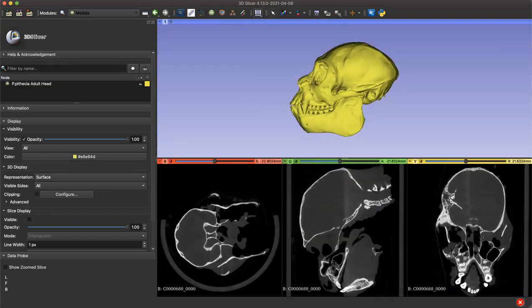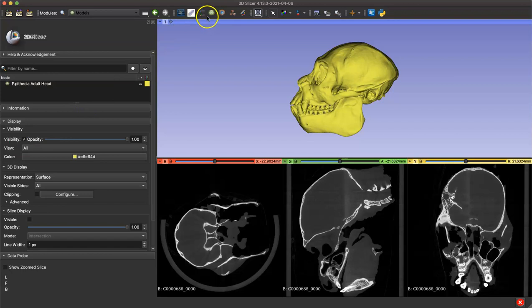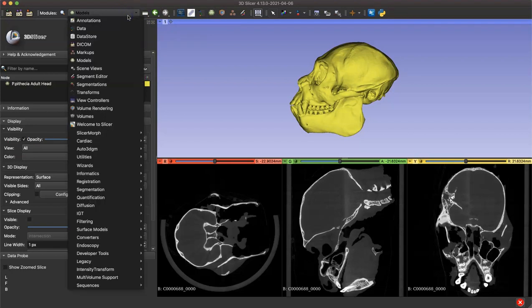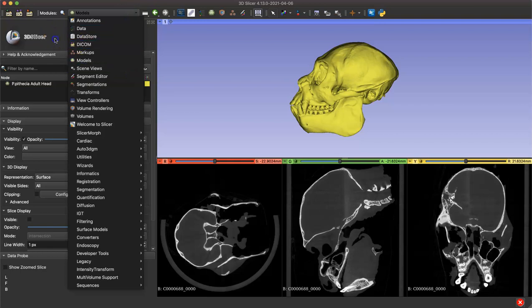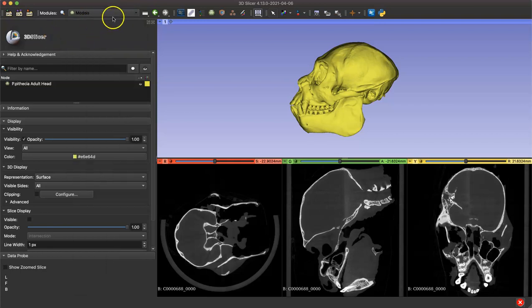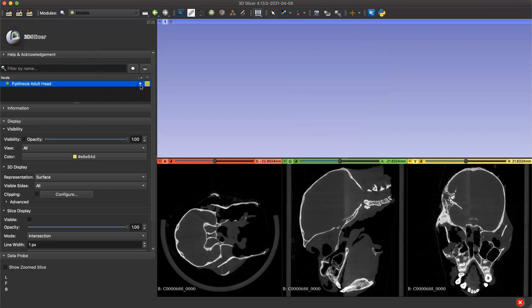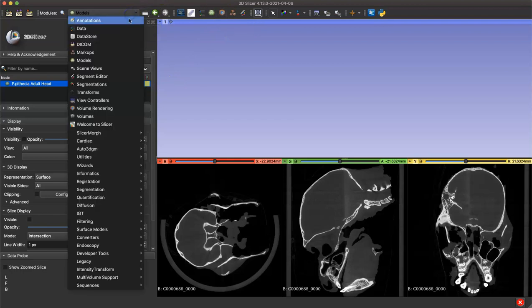I find it really useful to take my landmarks in the volume rendering mode instead of on this model. I'm going to navigate to my model module using either a customized shortcut at the top or this drop down menu, and I'm going to switch off the visibility of my model by clicking this eye symbol. Then I'm going to navigate to my volume rendering module by clicking the shortcut or using the drop down menu.